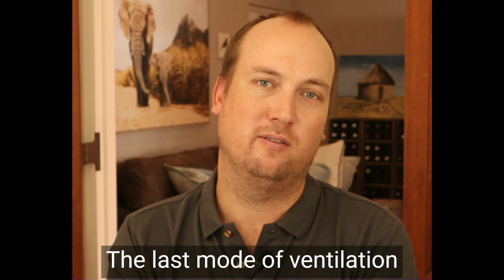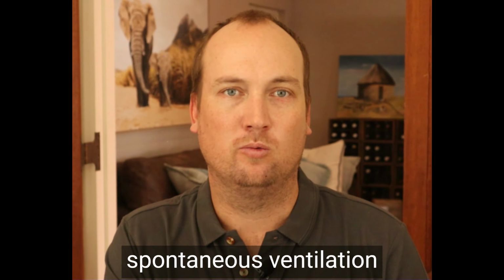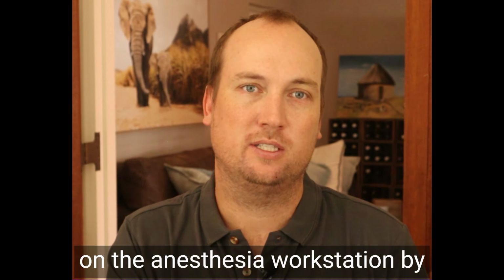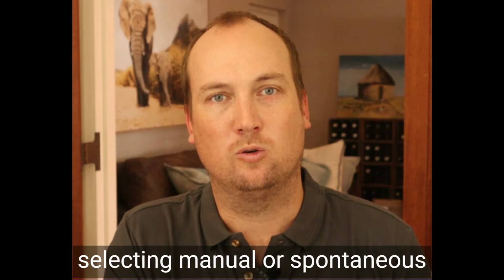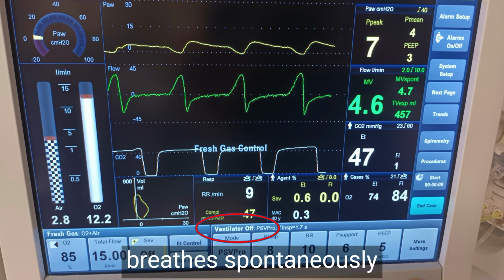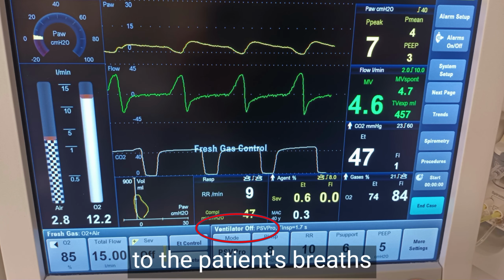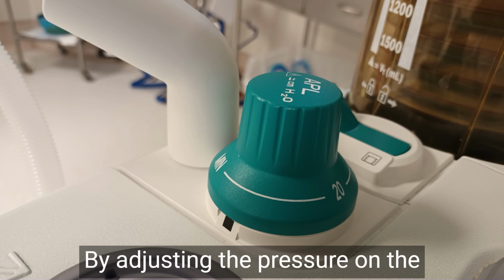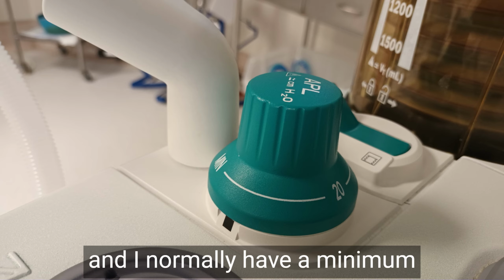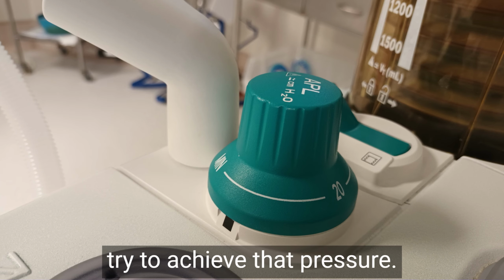The last mode of ventilation during anesthesia can be spontaneous ventilation without any support at all. And this mode is easily achieved on the anesthesia workstation by selecting manual or spontaneous breathing on the ventilator. In this scenario, the patient breathes spontaneously without any support. One can manually add PEEP to the patient's breaths by adjusting the pressure on the adjustable pressure release valve. And I normally have a minimum pressure of about 5 centimeters of water, so one can adjust the valve to try to achieve that pressure.